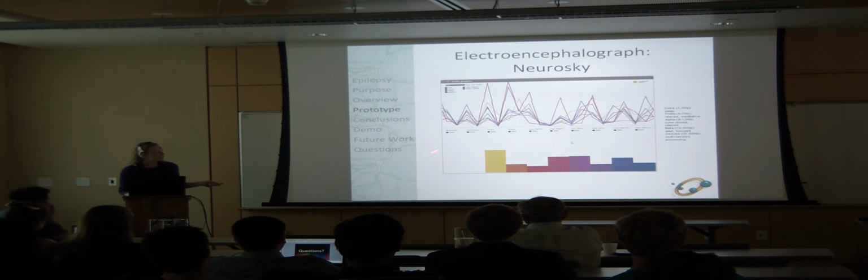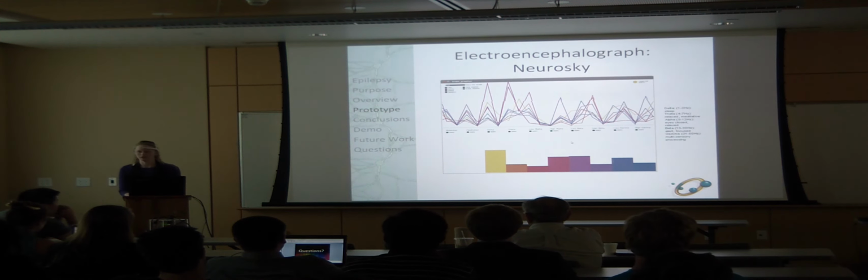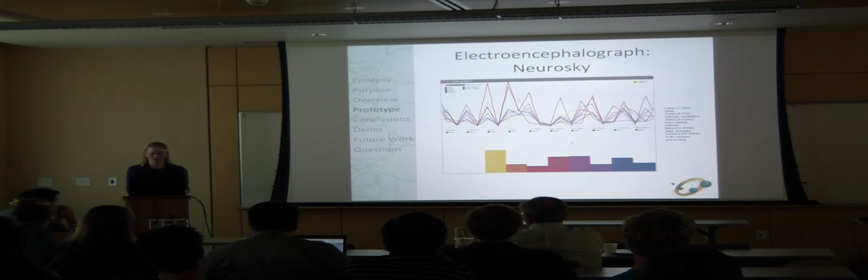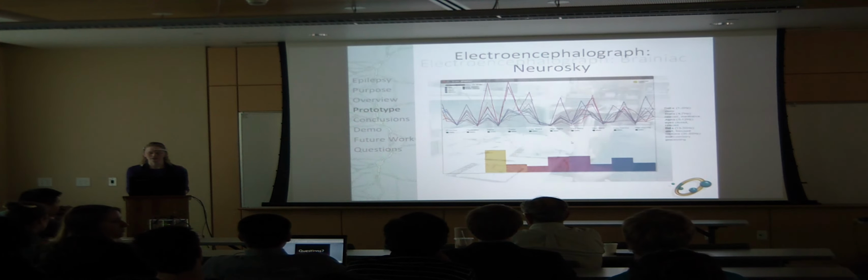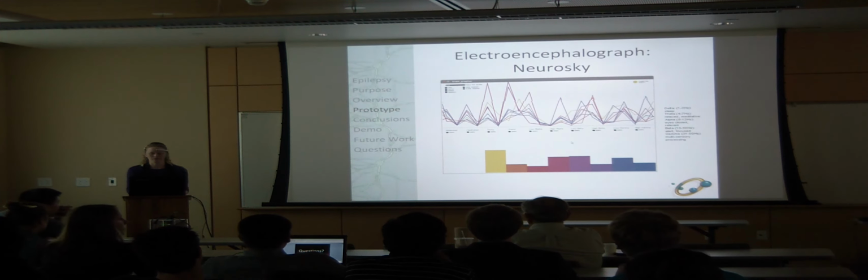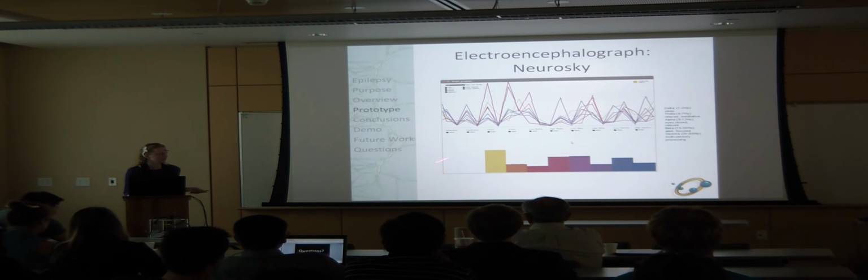These two values here are used in the NeuroSky controlled games, and all the literature that's out there doesn't really tell where these values come from, so I chose to exclude them here because I can't really tell you what they mean.